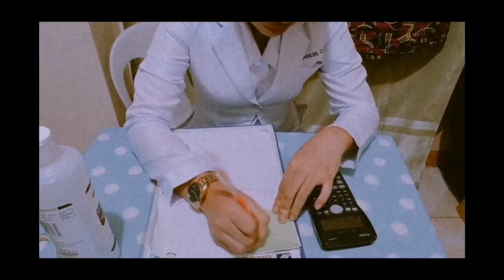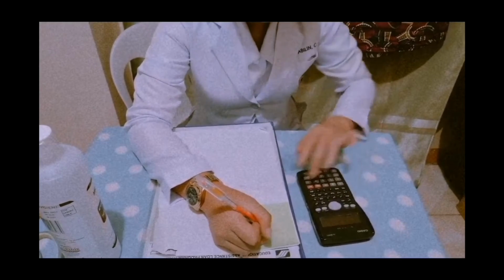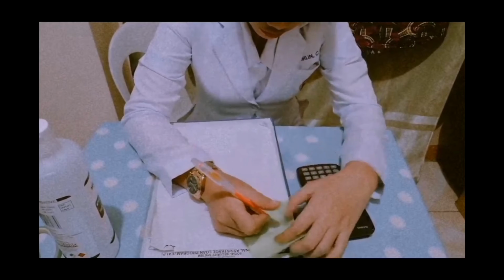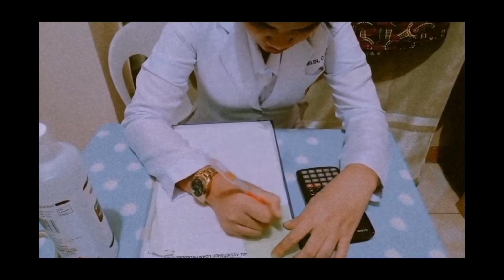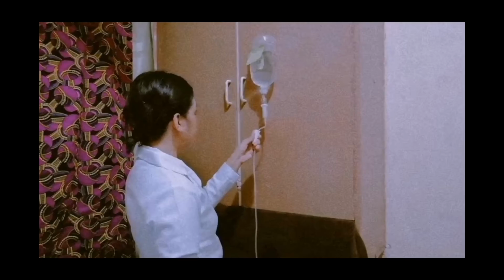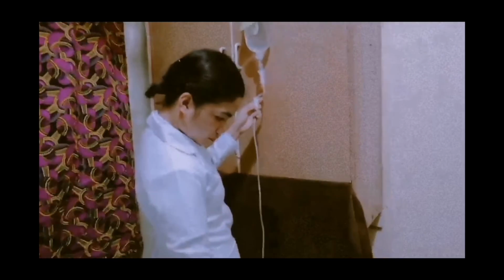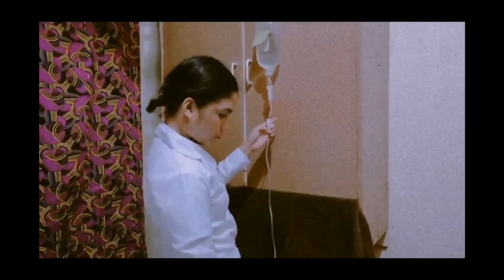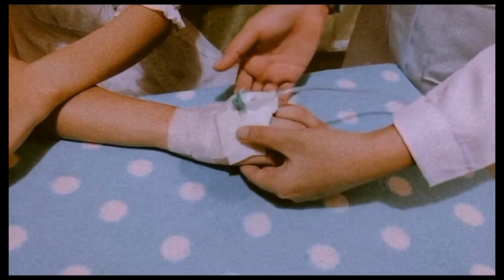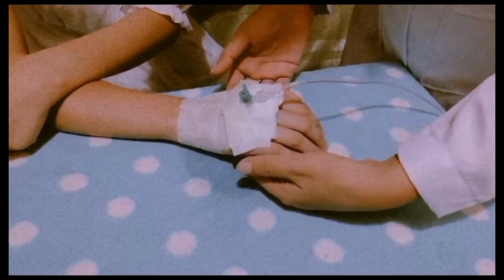Next procedure is to have paper and pencil or calculator to calculate flow rate. Use mathematical calculator or cycle to obtain correct rate. Next is to check patency of the IV line and needle. Any interference with the patency of the IV line will influence the IV flow rate.